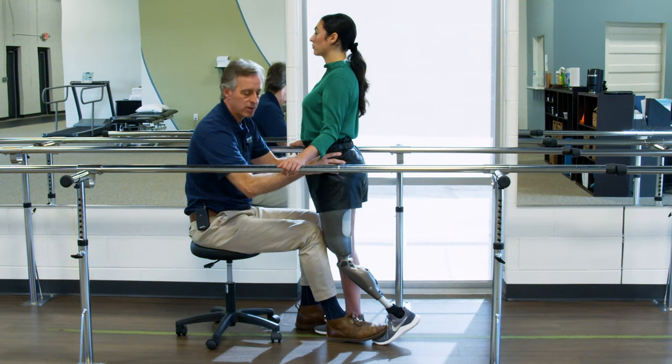Since we've released energy of that foot into making the knee bend, we want to take it all the way into a step. As you're pushing into me and feel that knee starting to bend — not after it bends, as it's beginning to bend — take a step. Don't kick, don't throw — just take a normal step. Bring that hip forward, feel it start to bend, step, and land, coming all the way forward. You'll find many people step and leave that leg stuck out in front — they're not under load. Always help the patient's hips finish coming all the way up on top of the prosthetic, fully loading on it, which puts them right in position for the next step.